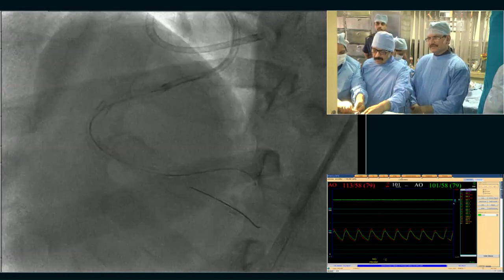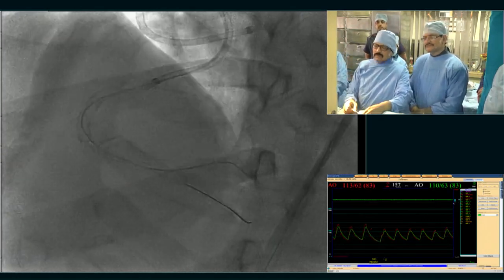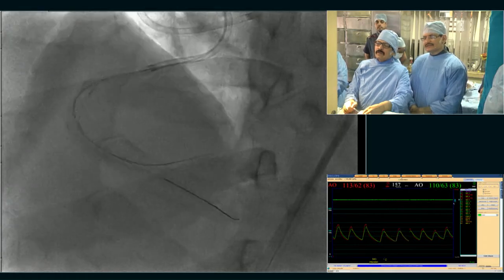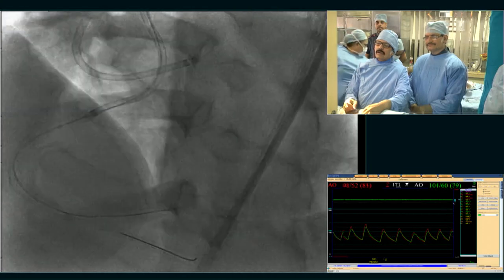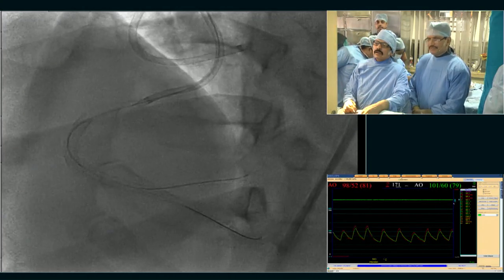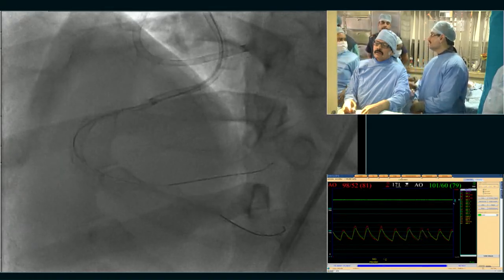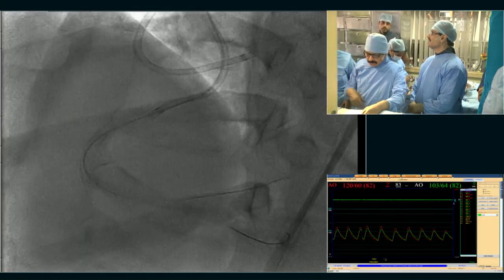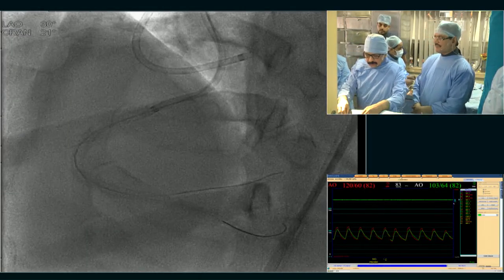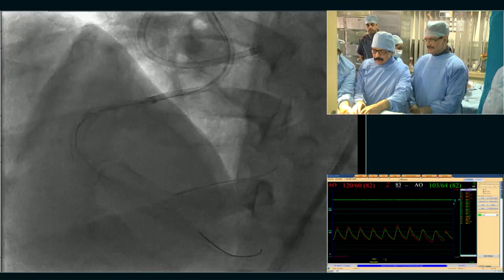First dilate the PLV. So now you plan to use a balloon? Yeah, balloon dilatation for the PLV ostium. Which one? What is the balloon? Take anything, 1.25, take 1.25. This is 1.5 mm. Yes, you can take. Okay.